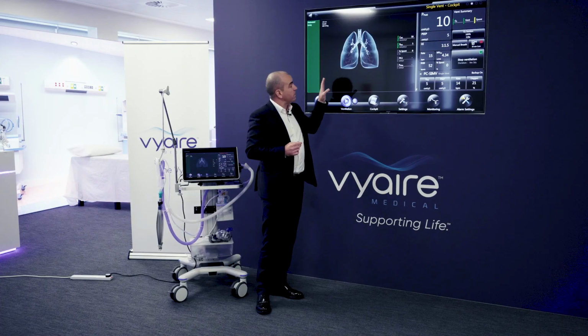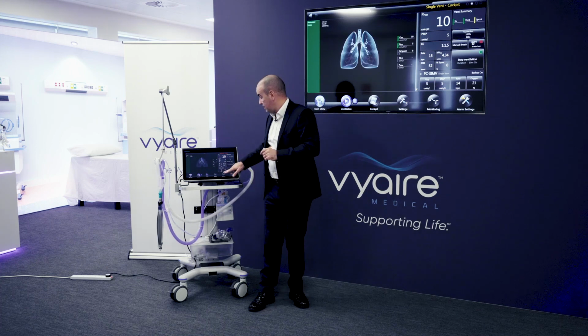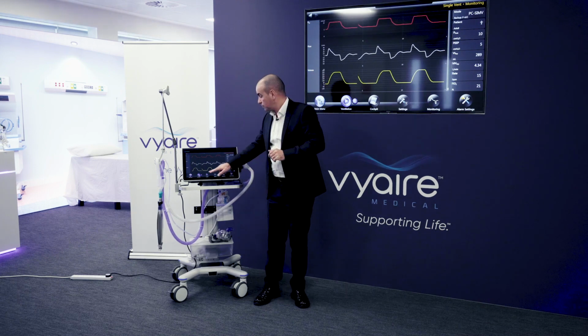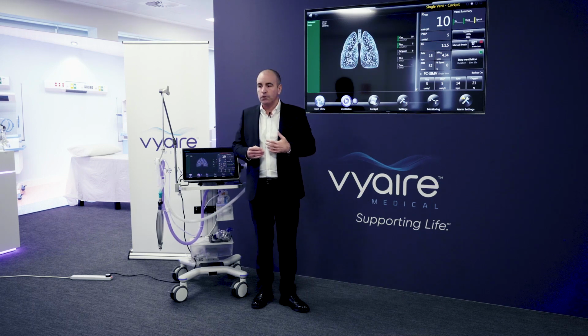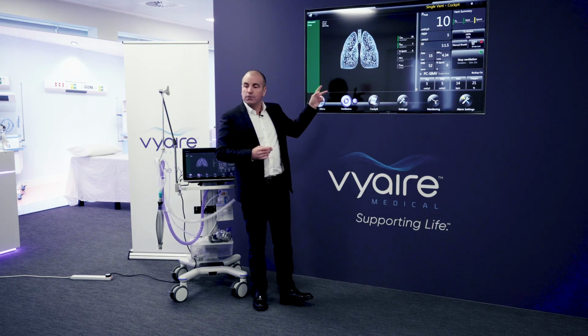So here we have a great visual cue that illustrates to the busy clinician that, granted, they might well be very comfortable analyzing, assessing this. But for the more junior staff or the new hires or the agency staff that they might have, this will be a good, useful tool.